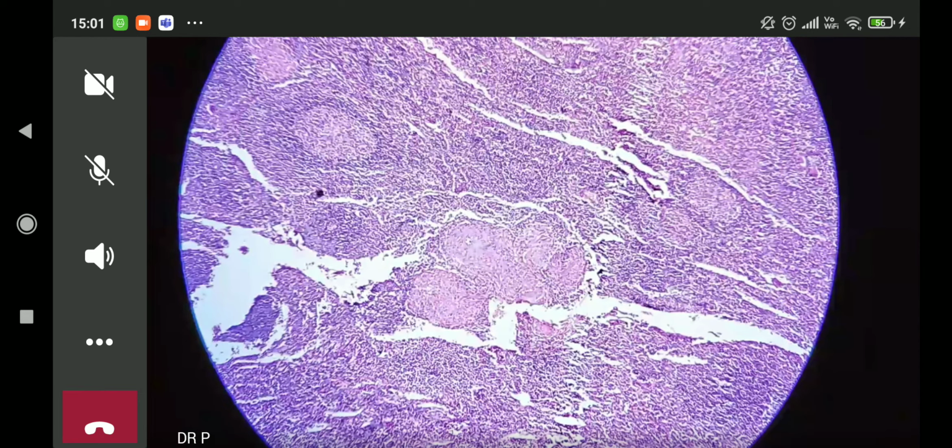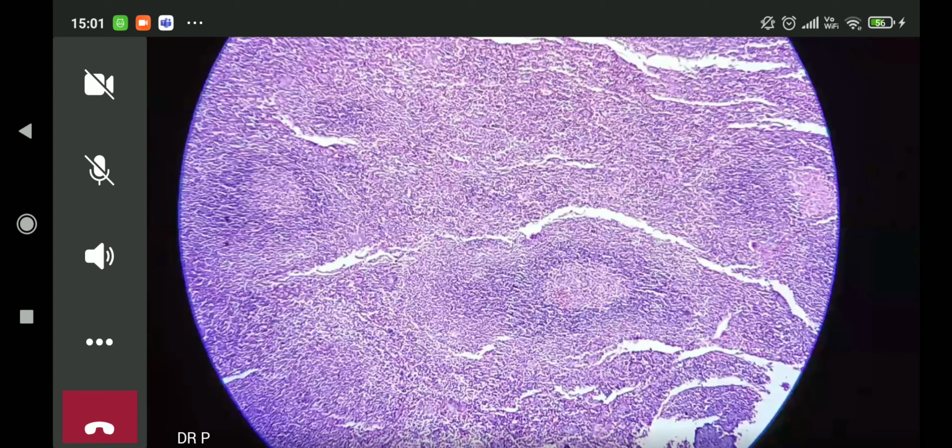You have a streaming collar of lymphocytes, right? The mantle. Look at this. Streaming collar, nice, well behaved, well educated collar of lymphocytes, right? So this is what you have. And then look at this. This is like some sort of misfit.